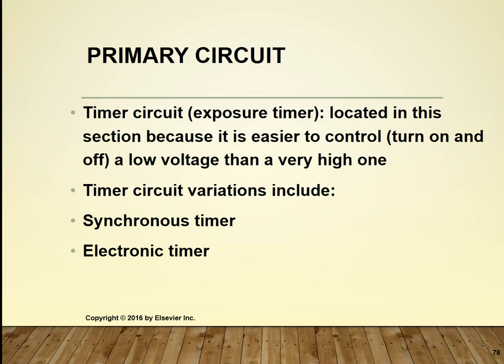longer to charge it. And what do we actually work in? I've said it, but you haven't actually gotten to use one yet. We work in milliseconds of exposure. So there's virtually no resistance, the capacitor charges very quickly, and the timer terminates the exposure. This is one application for a resistor in the X-ray circuit.